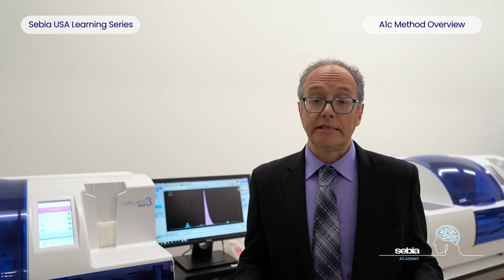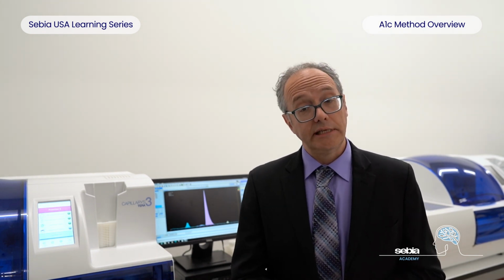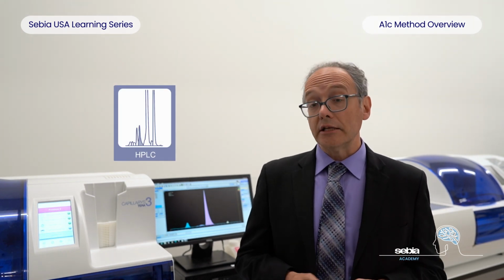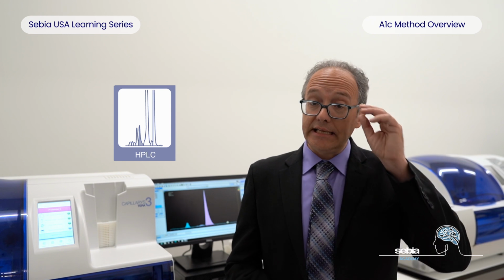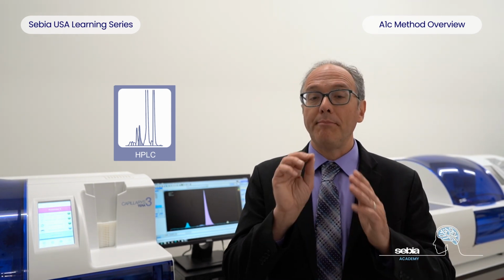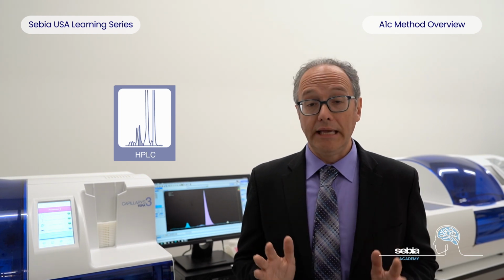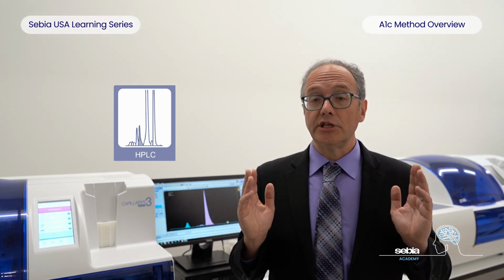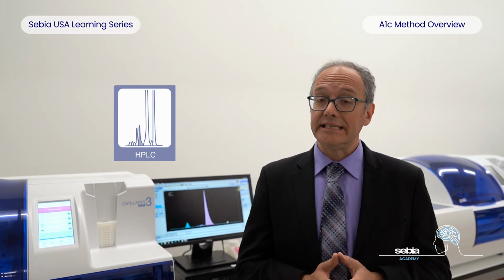In contrast, another method used for A1c testing is high-performance liquid chromatography, or HPLC. HPLC separates different types of hemoglobin based on their affinity for a packed column under different pH and ionic balances, allowing for the measurement of hemoglobin A1c as a percentage of total hemoglobin A. This leads to a patient result which displays the distribution of all hemoglobins in the patient's sample.